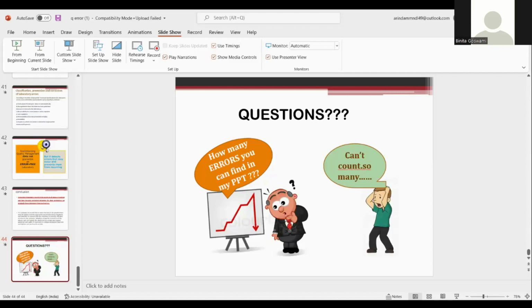Consistently low sodium in our lab around 130, but QCs are passing daily. Passing daily, sir. What could be the pre-analytical reason? There is no pre-analytical reason, I suppose. What you need to do, you have to come out of your lab mean. It's a question from Saif.